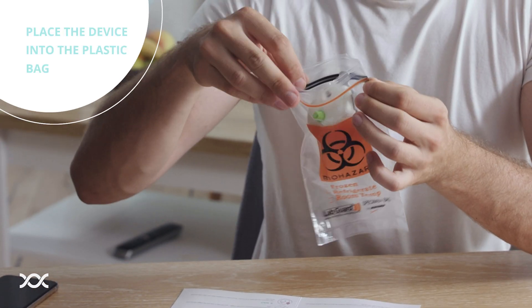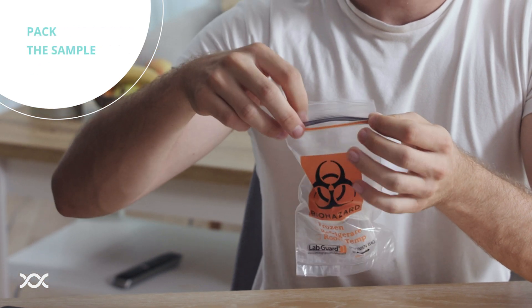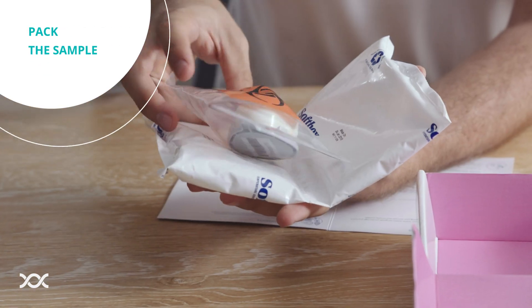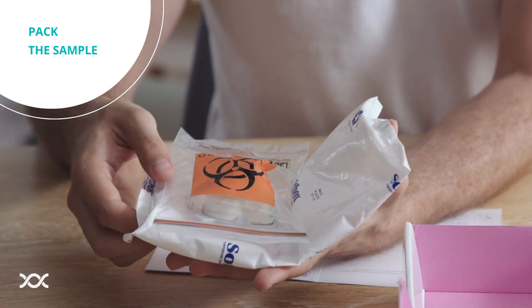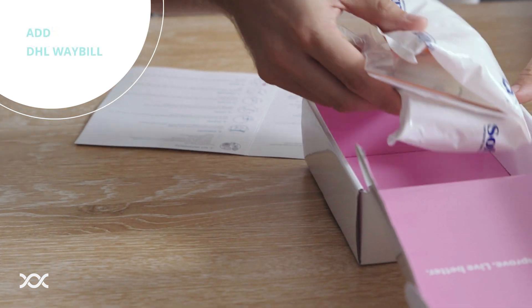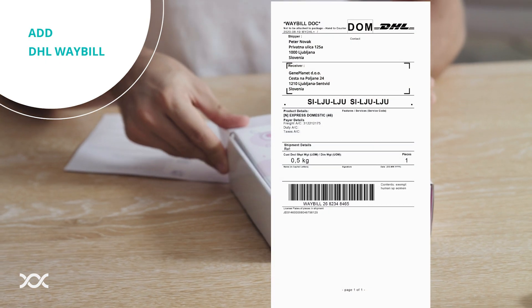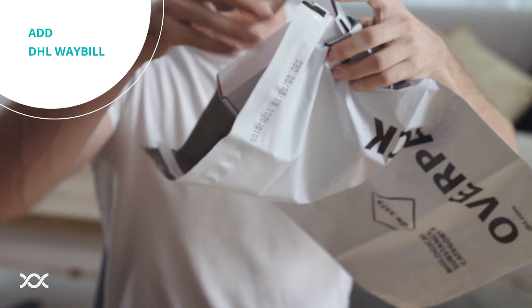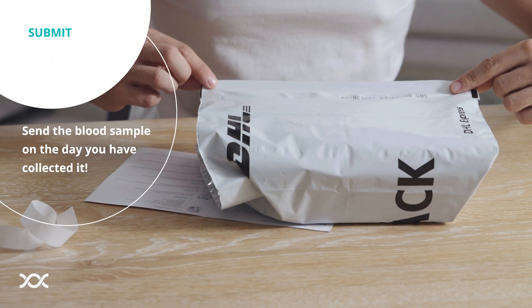Place the device into a biohazard bag, or for even better protection, place the device in the plastic shell. Surround the device with the gel pack. Gently place everything into the box and close it. Put the prepared DHL waybill into the pocket of the white shipping bag. Put the box into the white shipping bag and submit it to the courier.